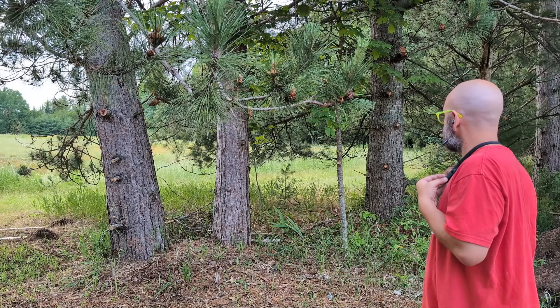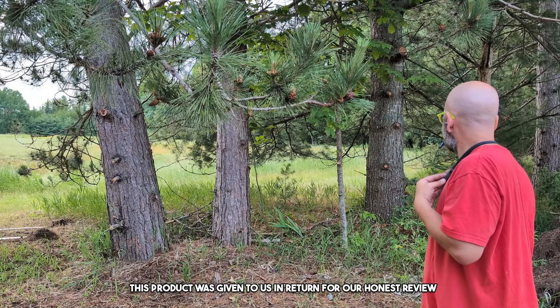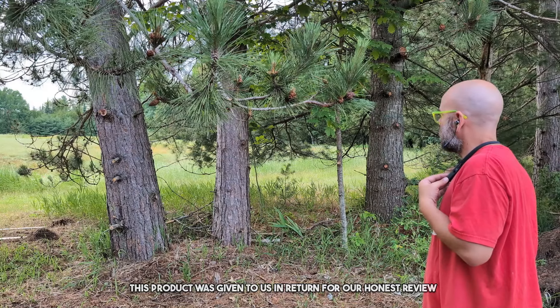These hearing aids really amplify the sounds. Welcome to the review. Today, we're doing a review of these rechargeable hearing aids. This product was sent to us in return for our honest review.